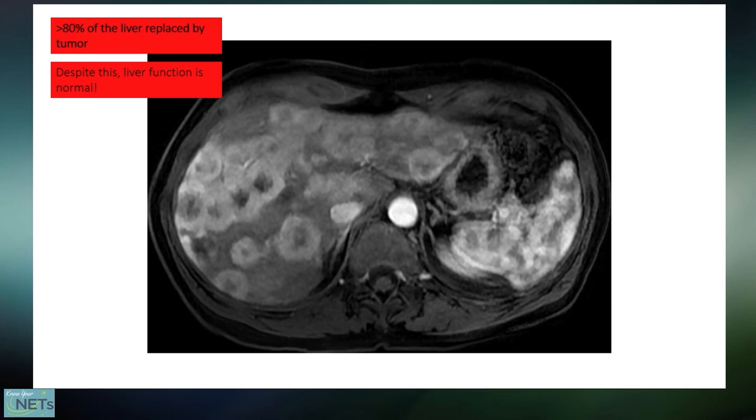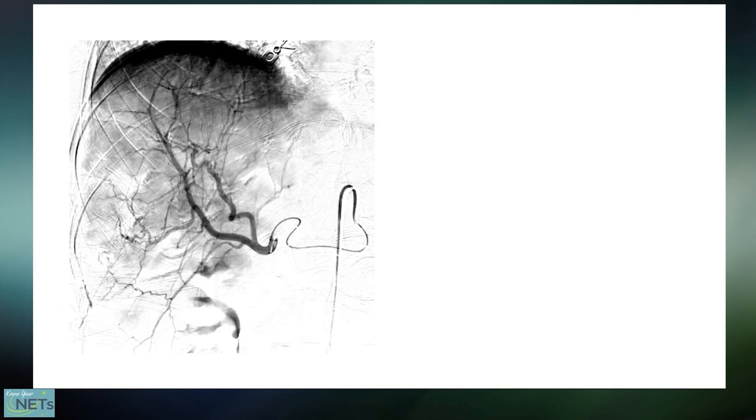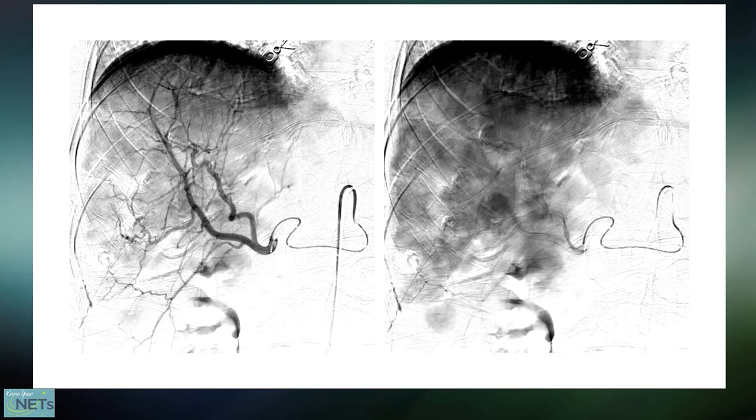almost always yes. As long as the liver function is normal, which as we talked about, the liver is very resilient, and the patient is doing well health-wise, we can treat this patient. And this is what allows us to do this and be minimally invasive. So as you can see here, this is the angiogram again. This is going to be a common theme. You can see here, this is what it looks like, especially after we inject dye and then we watch it like a movie in real time. And you can actually see there's multiple tumors.